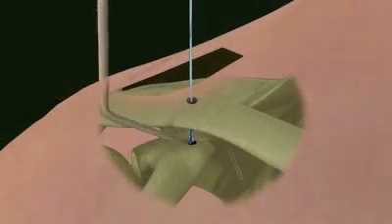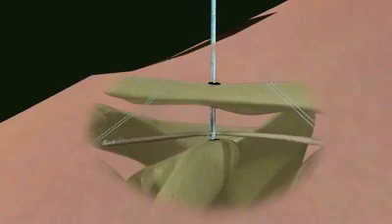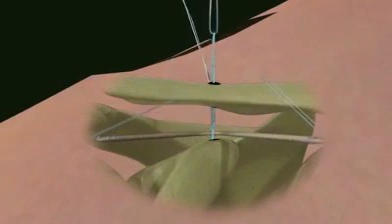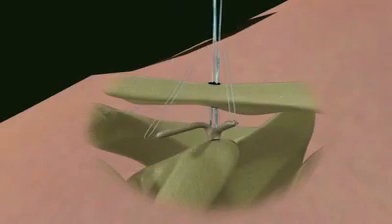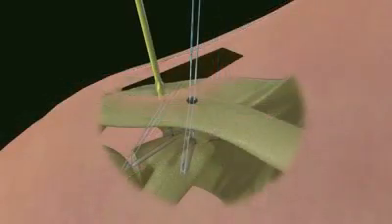Place the prepared graft in the first zip loop of the double zip loop construct. Pull this zip strand to fixate the graft into the 6.0 mm hole on top of the coracoid.